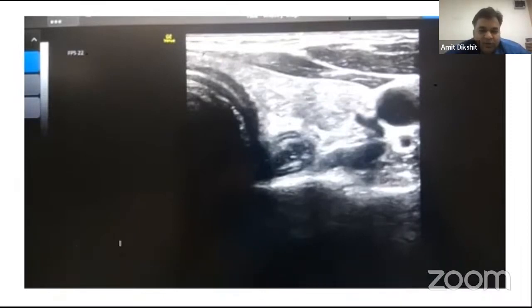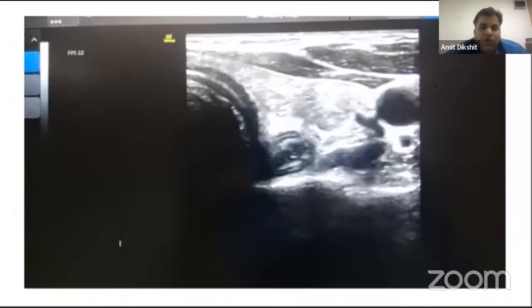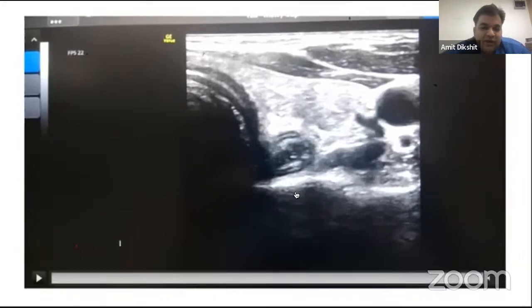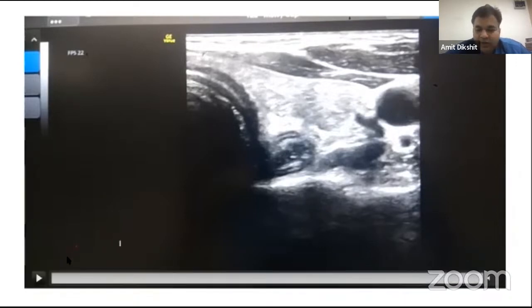So we always talk about regional anesthesia, the interscalene block, and laryngeal involvement if too much drug sits here. That's the importance of this area for an anesthetist. When we see this esophagus very well, there is another question: where should we provide the cricoid pressure? I think this has changed the way we look. Once we park the probe and see the esophagus, we may push it and try to occlude it at the time of rapid sequence induction. So this is another insight.